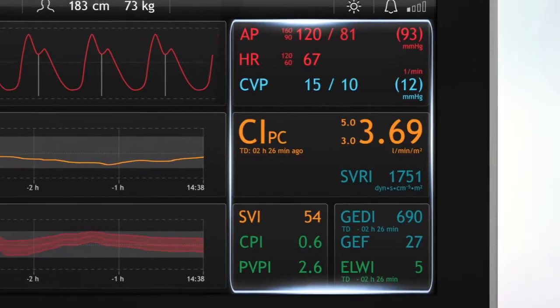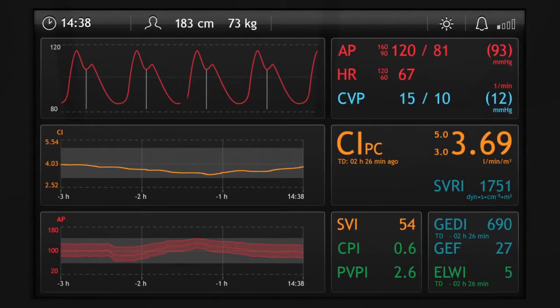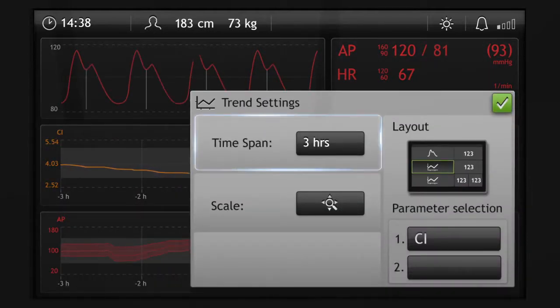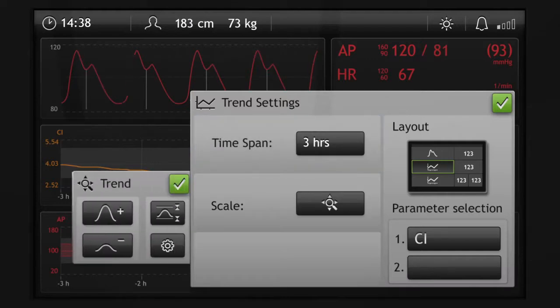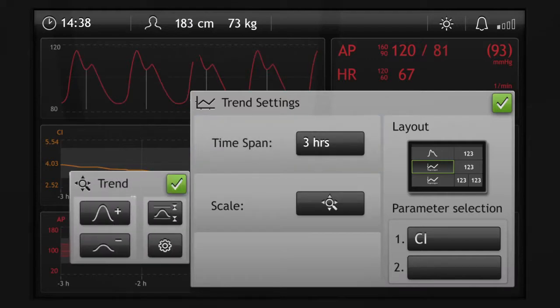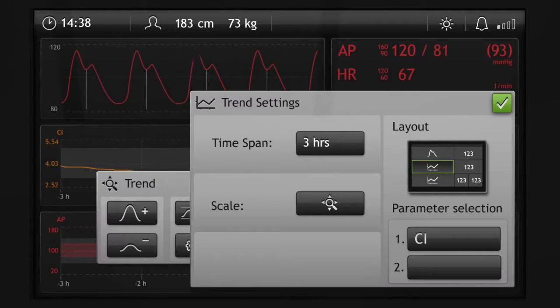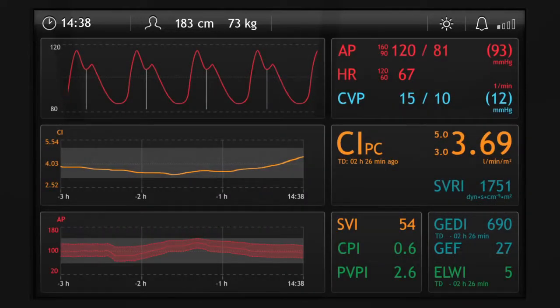To configure the trend settings, tap the trend area, then select the trend parameter. You can select a time span. For trend scaling, press the plus or minus curves or the auto scaling button. Both trend areas can be individually configured. The trend bar can be moved to display the desired time range.